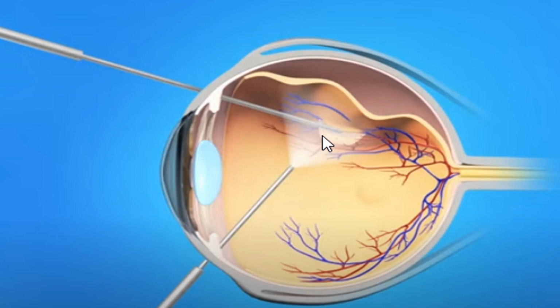vitrectomy. Okay, after completing the vitrectomy, which removes the vitreous that may be the source of this detachment or the source of this tear, especially in the case of tractional RD. Okay, so it will be pulling the retina away from its place. So I am separating the vitreous and taking it out with vitrectomy. And guess, will we leave this whole space like this? Of course not, because if you left it like this, you may face recurrent RD.